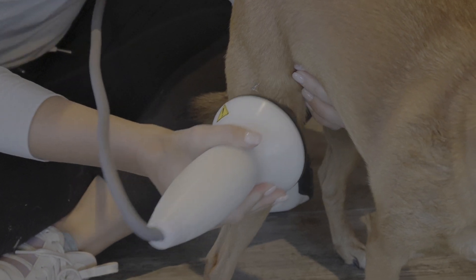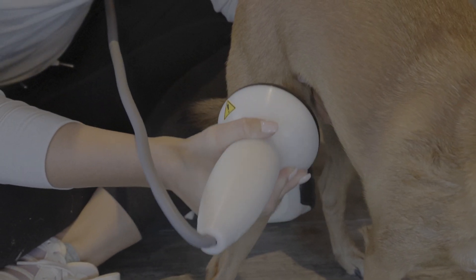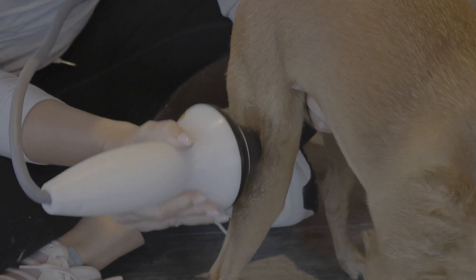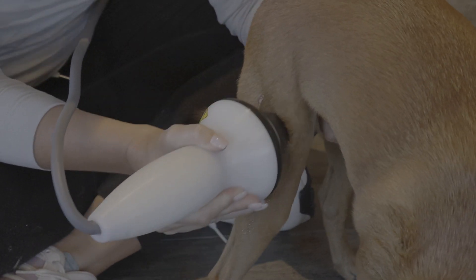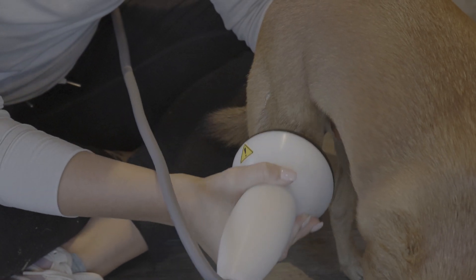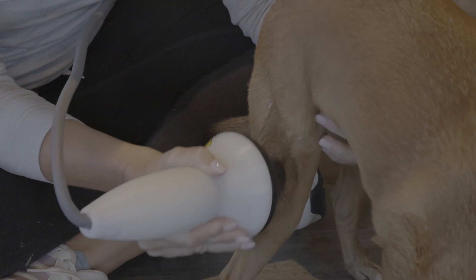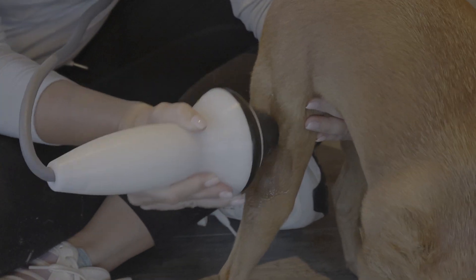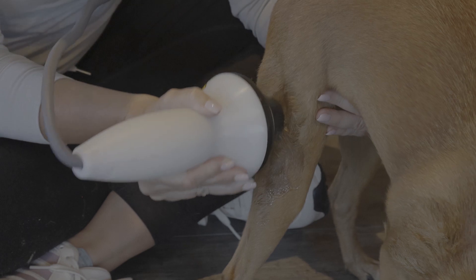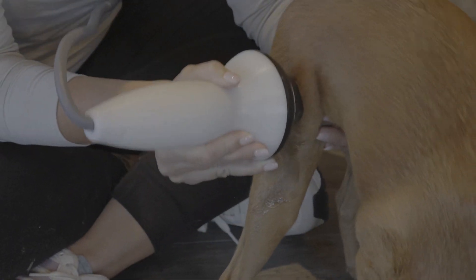To treat the stifle, we want to start a little bit away from the joint, up on the muscles of this lower thigh here, and we want to be slowly moving, making good contact with the trode with lots of gel. We want to make sure that the middle of the trode is angled in to the area we're trying to treat, and that we're treating 360 degrees and 3D all around the joint.